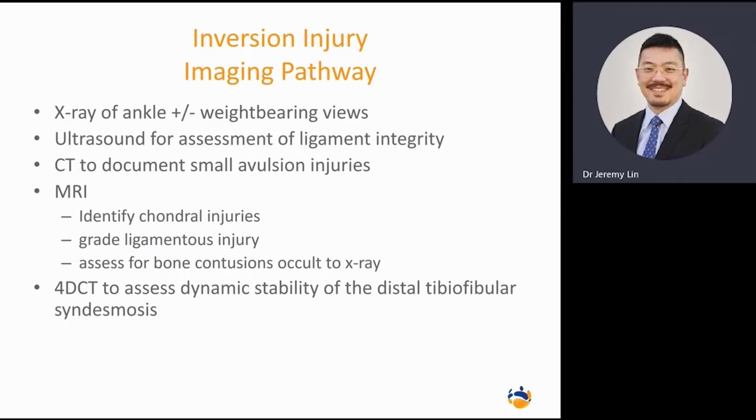Now, I am uncertain as to what is currently happening, but from my understanding, Medicare has started discouraging us from doing self-directed studies or add-on studies in addition to what is on the referral. So I'm not sure whether or not our old practice of saying, that's fine, let's go and get some weight-bearing views just to see if there's any syndesmotic widening is still kosher, or whether it would be better for referrers such as yourself to actually just put on plus or minus weight-bearing views. And the same thing goes for ultrasound.